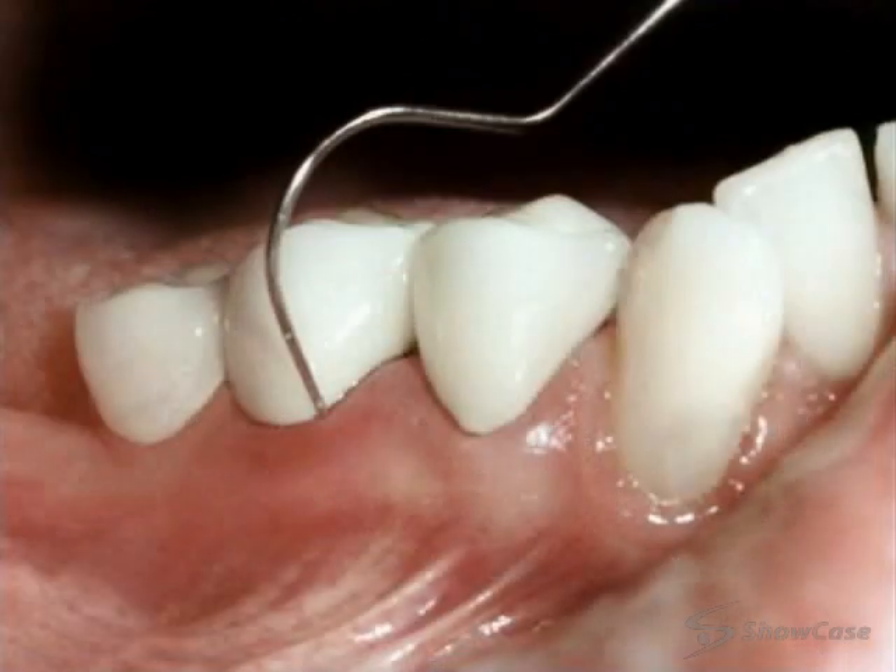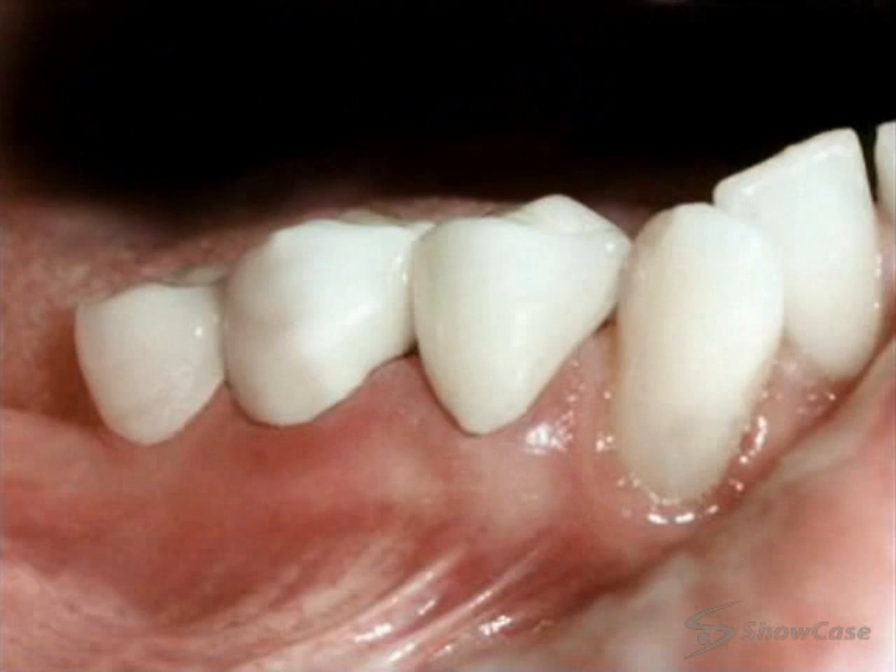We check the fit and the bite. When everything looks good, we bond or cement the bridge in place.